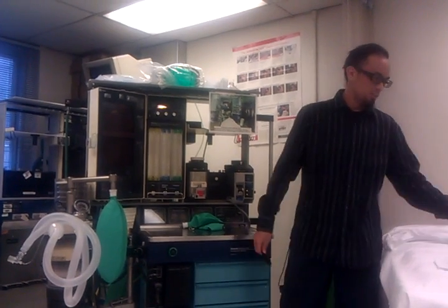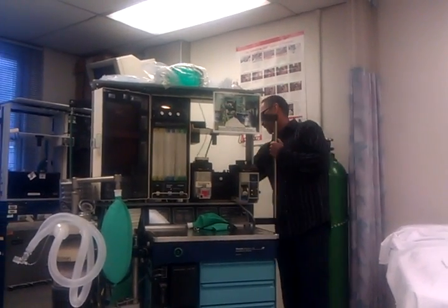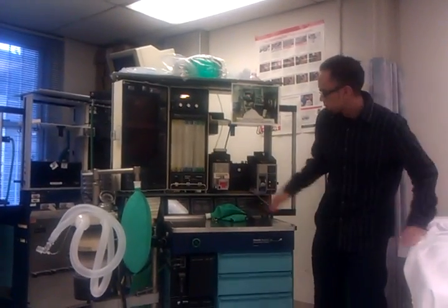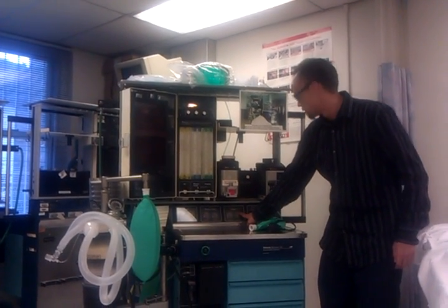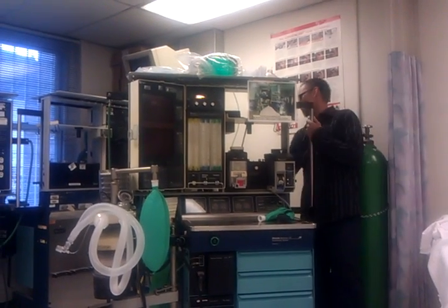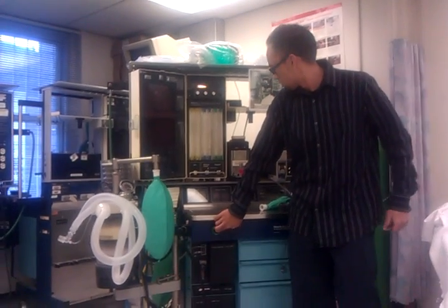I want to check my backup cylinder PSI slash pressure. I'm going to go ahead and open it up. I should read about 1,000 PSI on the cylinder gauge — minimum is 1,000. Right now it's reading about 2,000, so I'm good. I'll go ahead and close it and flush that excess air out.